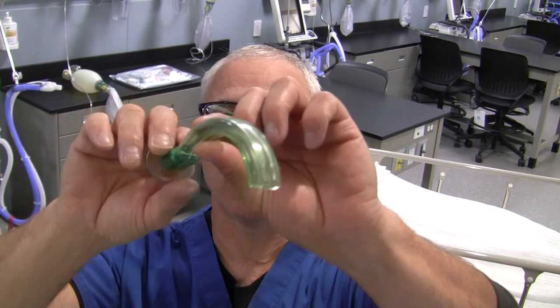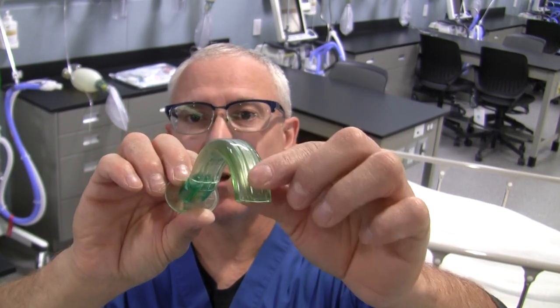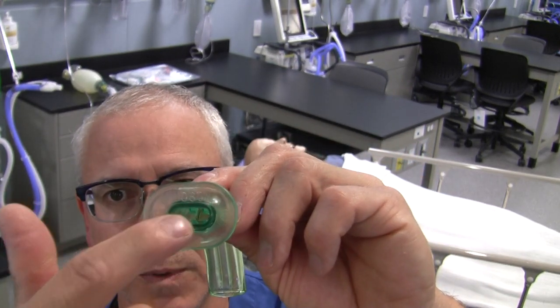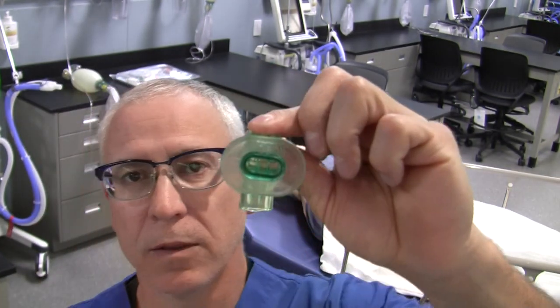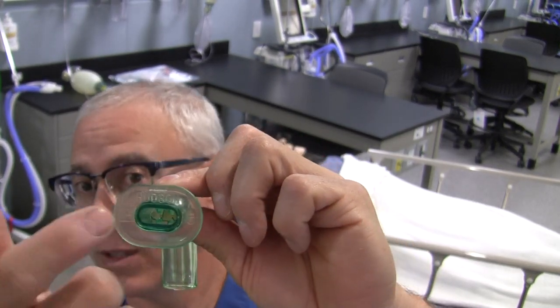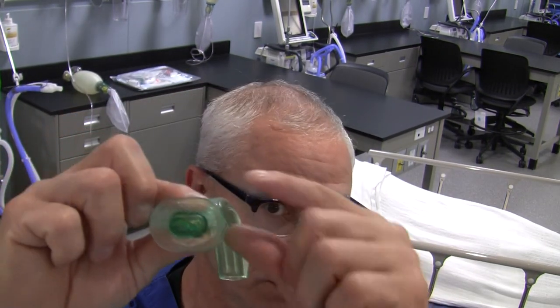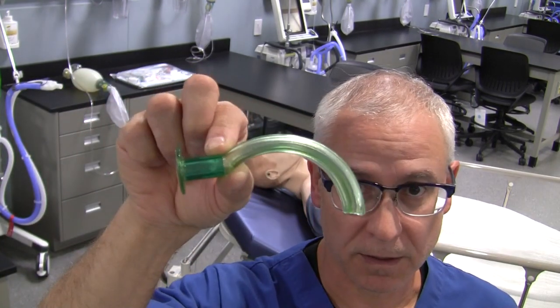The last part of the OPA is the channeled, slightly softer distal portion. This part should be sitting between the base of the tongue and the posterior pharynx. The OPA is hollow all the way through its length, allowing gas to pass through it. You can also pass a smaller suction catheter through the channel, or run a catheter along the side of the OPA to suction the posterior pharynx if the patient has a lot of secretions.